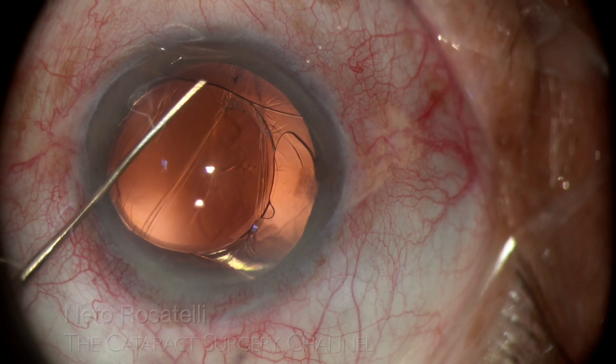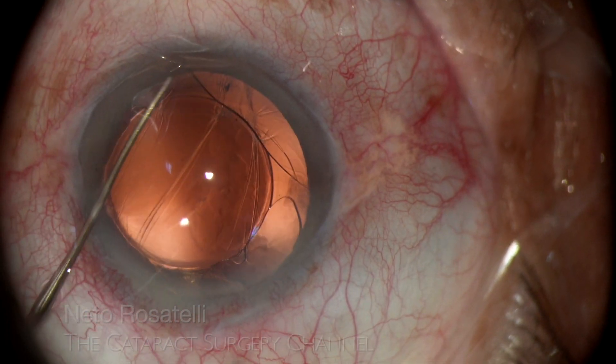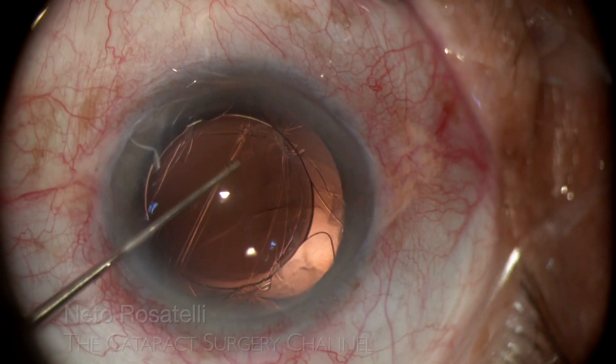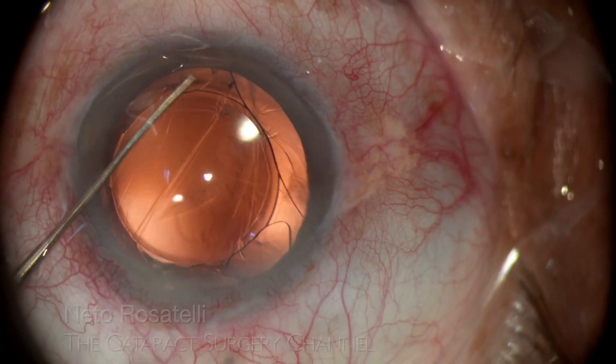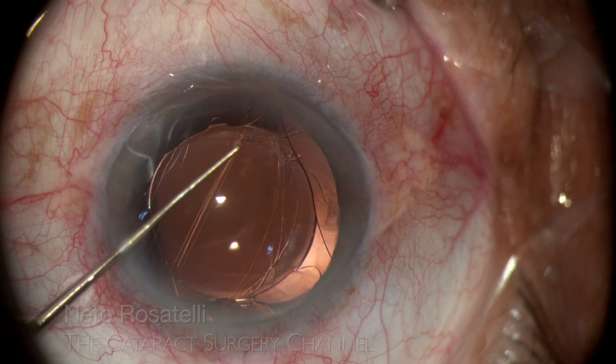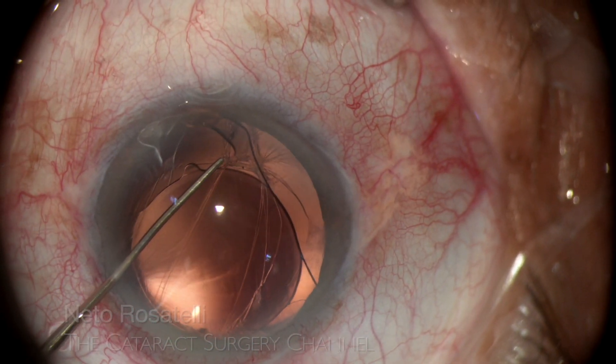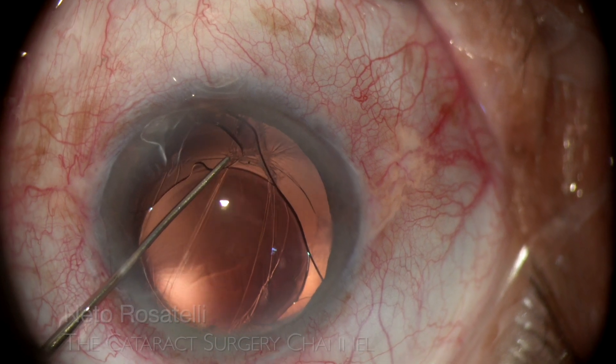After pulling out one of the haptics back to the anterior chamber, I can see that the oval aperture of the capsules can easily be used to capture the IOL through its haptics. If successful, this would make for an excellent correction of the situation.